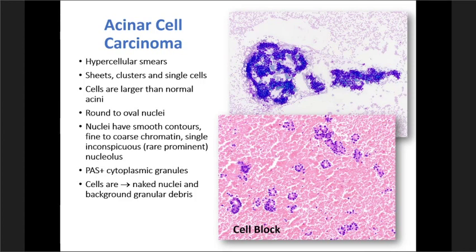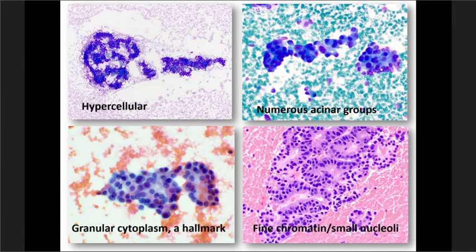That's another clue there. Remember, the cytoplasm has this granularity, and those are zymogen granules. And on PAS stain, they can give you this very classic red appearance. So this is what would help you. Also remember, how do you exclude these, just on eyeballing these cases, from neuroendocrine tumors is presence of mitotic activity. These tumors will be highly mitotically active in contrast to well-differentiated neuroendocrine tumors.